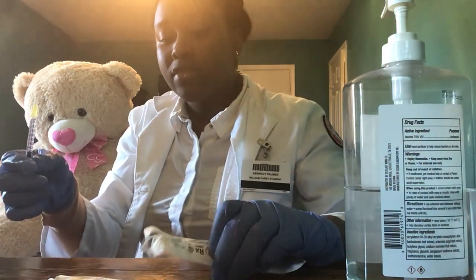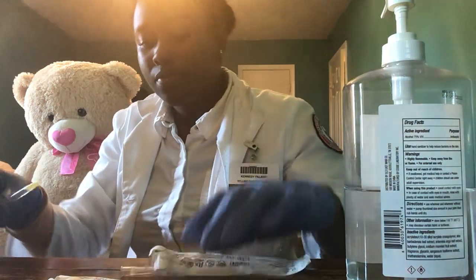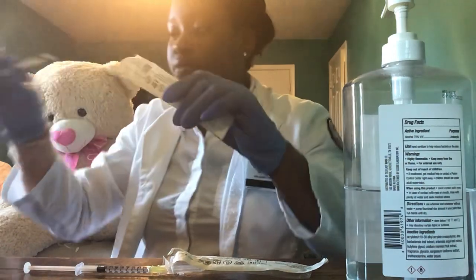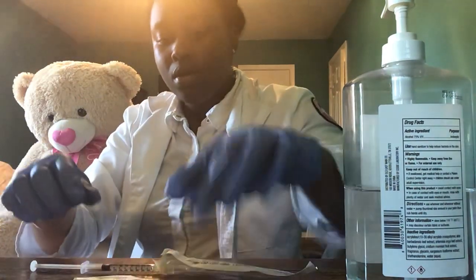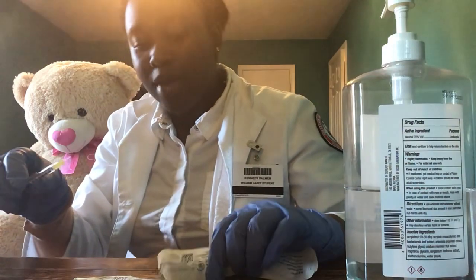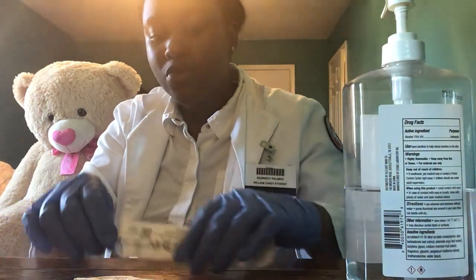Okay. And I'm just going to use the swoop method to recap the needle so that way I can change the needles out. Okay. And now I'm going to remove, oops, I need to do the swoop method again to recap it because the needle did not come off when I tried to remove it.